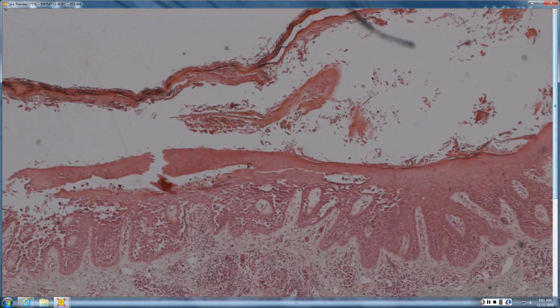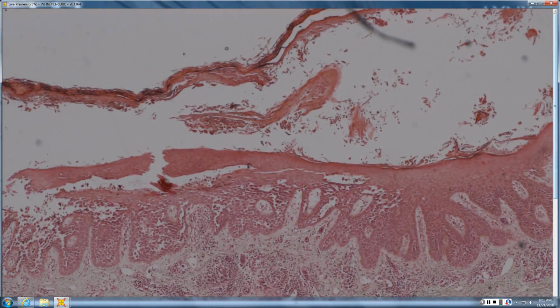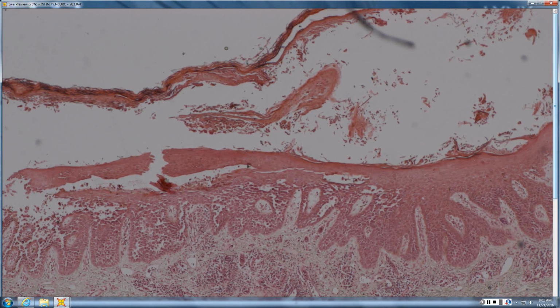So this sounds like an intraepidermal sort of acantholysis. I thought it was more consistent with Hailey-Hailey, but I guess pemphigus vulgaris would be in your differential. Of course, TAD is always in your differential for an acantholytic disorder. Darier's might be in your differential as well. Hailey-Hailey, and you are correct, that's what this is, always gives you acanthosis as well as a full thickness dilapidated brick wall type of acantholysis.